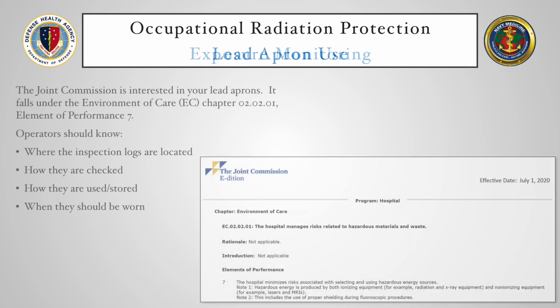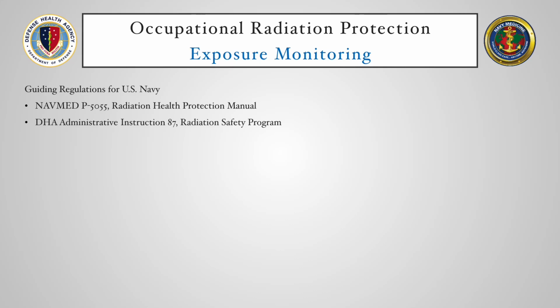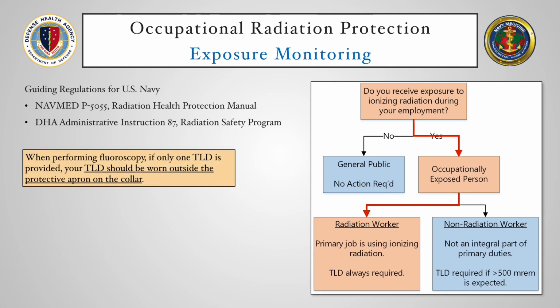The guiding regulations for the U.S. Navy are the NAVMED P5055, the Radiation Protection Manual, and DHA Administrative Instruction 87 for radiation safety programs. Basically, as a radiologist, medical physicist, or radiologic technologist, working with radiation is your primary job, so TLD wear is always required. Now please note, when you're performing fluoroscopy, if only one TLD is provided by your department, your TLD should be worn on the outside of your protective apron on the collar.